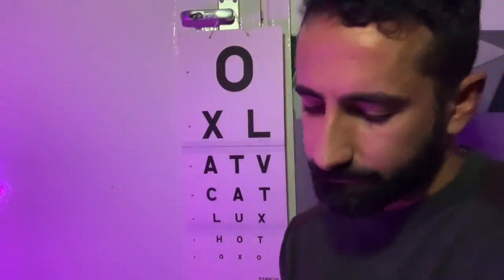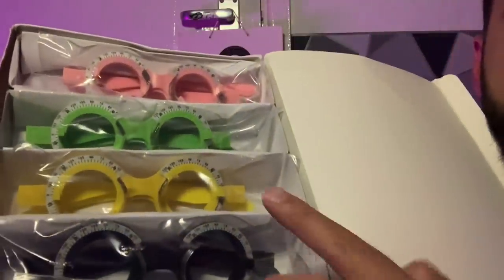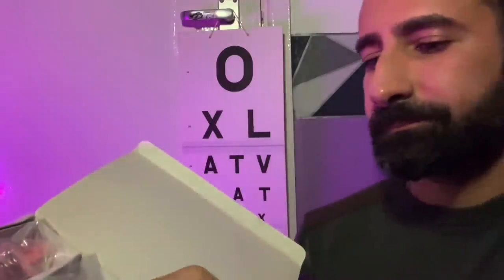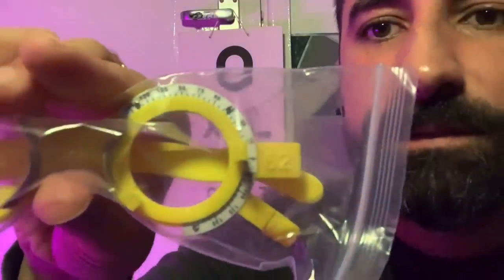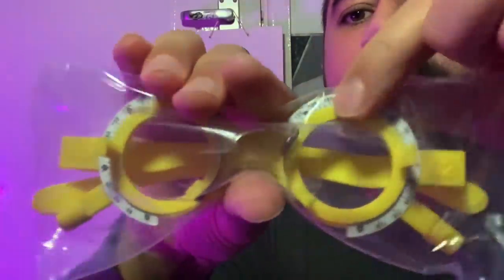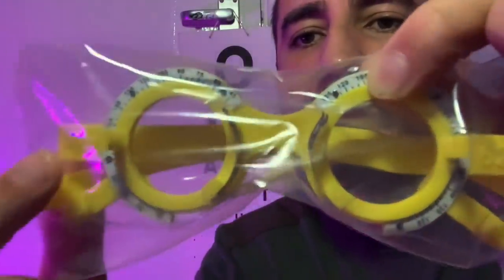Let's have a look which frame that correlates to. 62 millimeters. Oh yes, 62 millimeters is the yellow trial frame here. So this is the trial frame I'll be using today. A 62 millimeter setting, the distance between the center of the holders there is 62 millimeters. Lenses will be perfect for your optical centres.